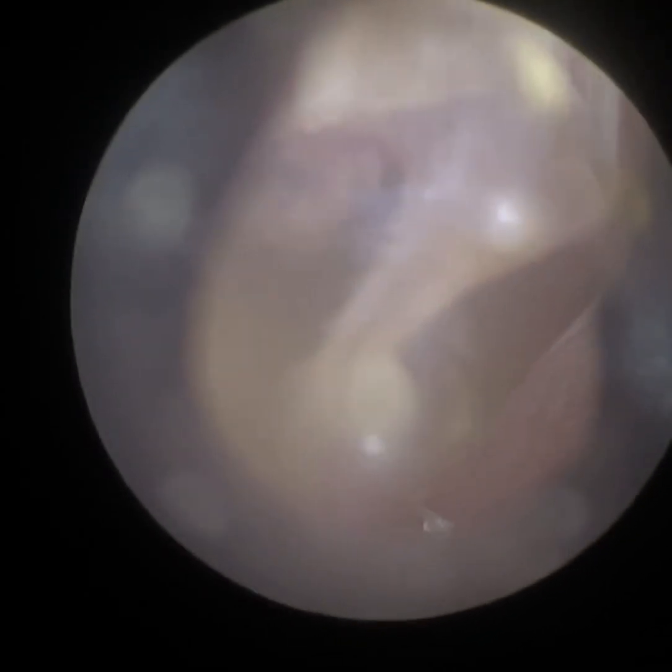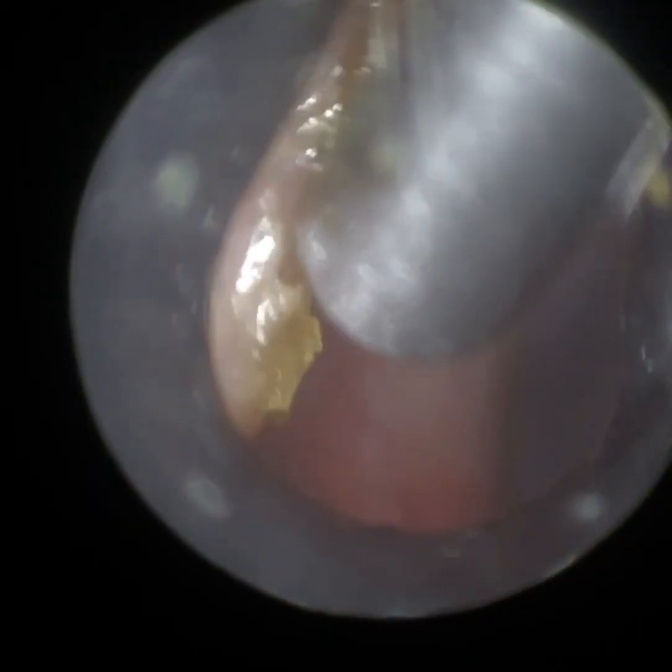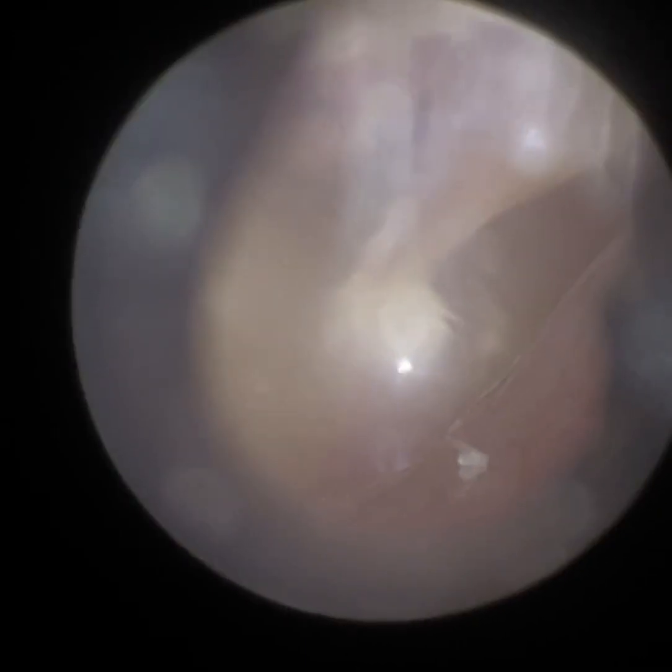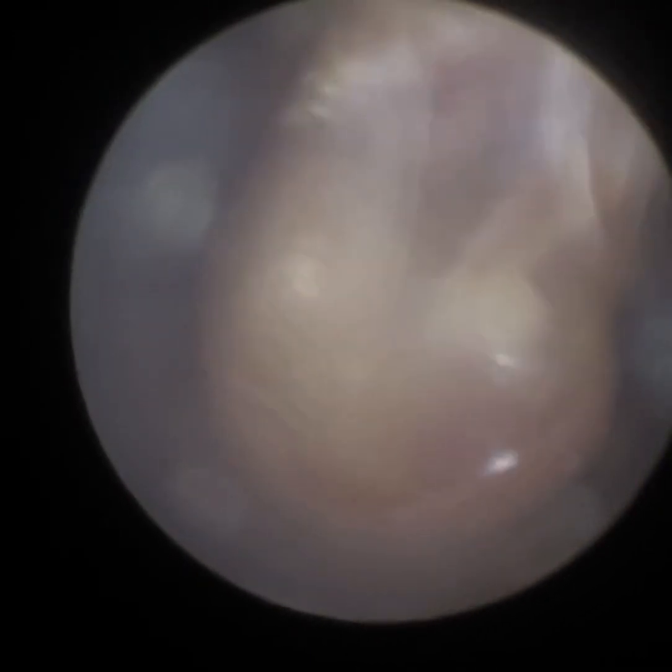Just looking at the patient's eardrum there — we've just adjusted the focus and we've got a fantastic view. You can even see the incus there and the long process of the incus. Just some dead skin laterally near the entrance; I'm just going to go back in with the sucker to mop that up for the patient. You can see how clear that image is. Because with the Waxscope the lens is out of the ear, not in it, so there's no chance of obstruction with the instrument, giving you all the operational space within the ear canal.